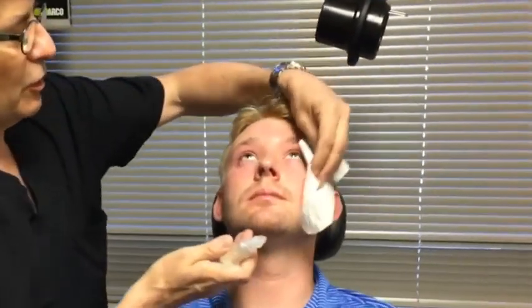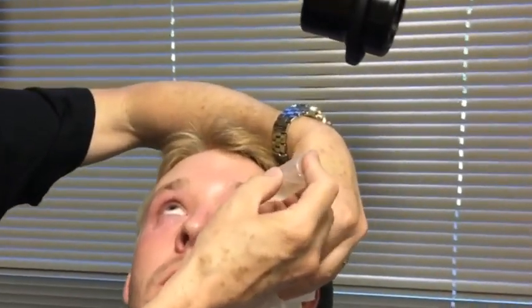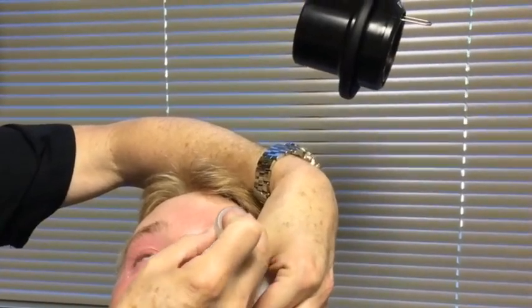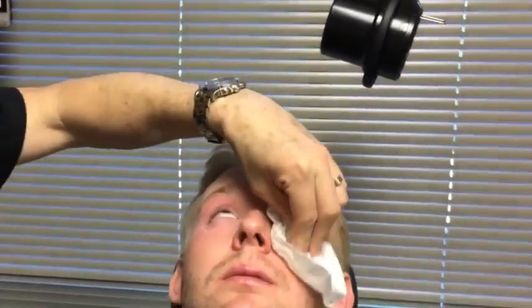So now the left eye is complete. Have the patient tip back, hold your tissue. Again, we're going to just squirt a few drops right there on the eye. Try to catch the efflux, squirt it right in, blink, blink, blink. And that's it.